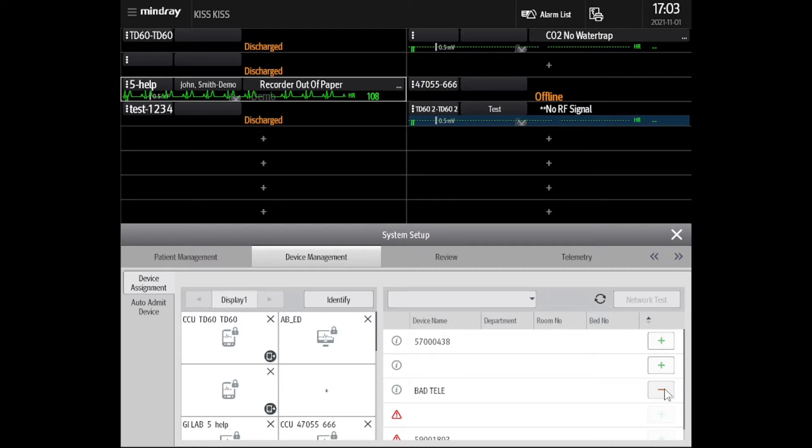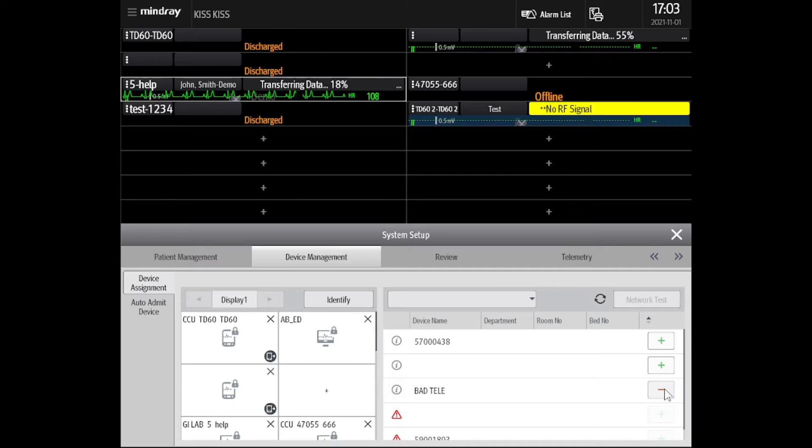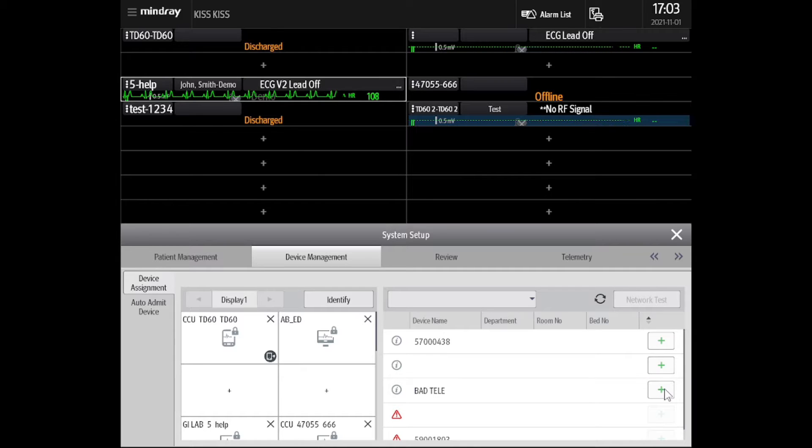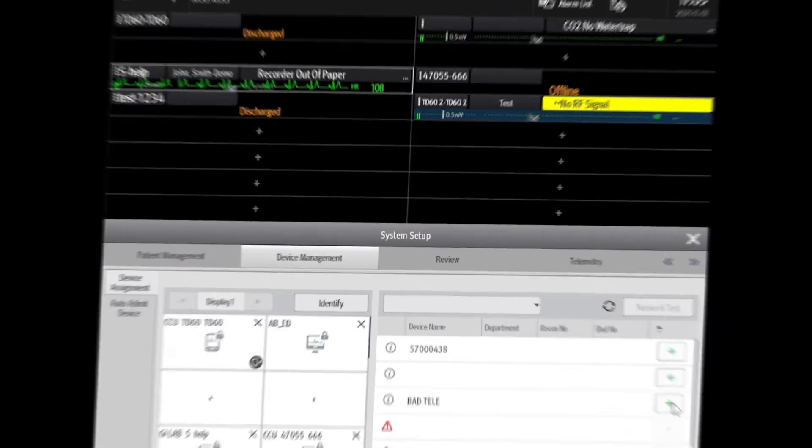Please note, removing from the server will automatically delete its configuration on all workstations. This needs to be manually added back once it's replaced. Once removed, we may now begin the process of replacing the TM80.